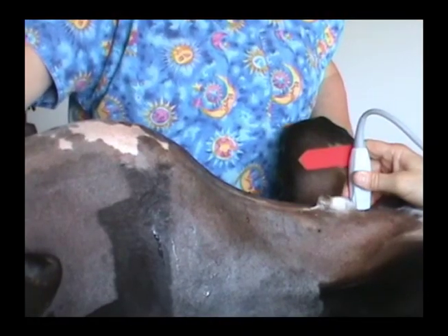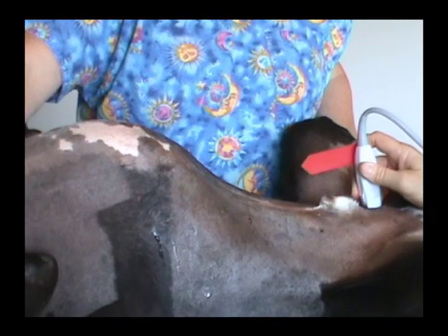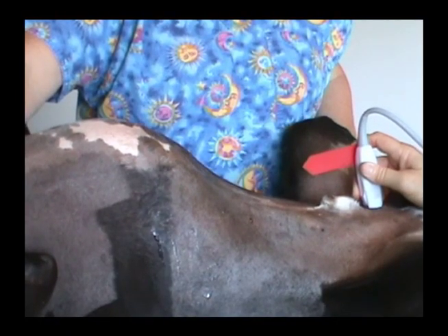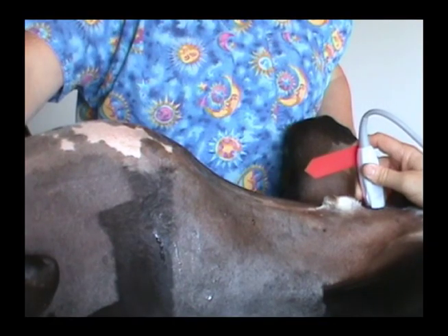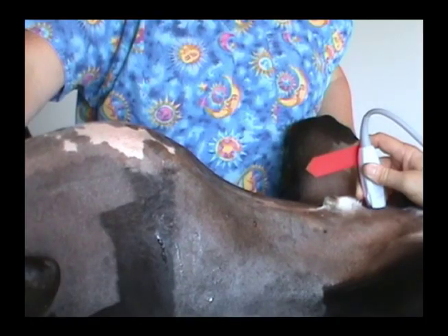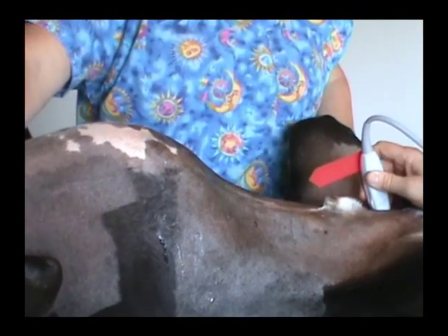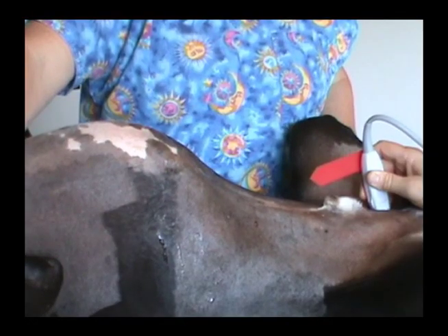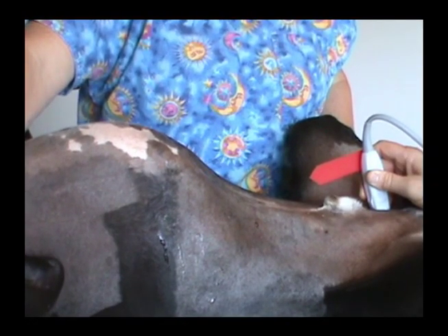The prostate is not usually seen in male cats because of its location within the pelvic canal. In dogs, the prostate is caudal to the urinary bladder. When you finish the exam of the urinary bladder, the transducer should be in a sagittal position over the urethra. We will use the 95-pound Great Dane for the prostate.